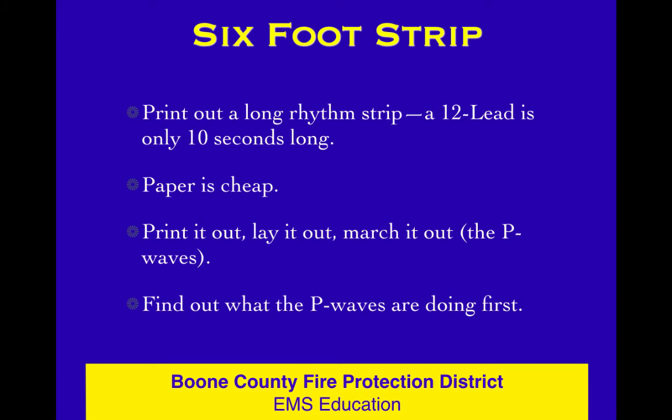Hey, you're going to be new medics. New medics are supposed to walk around with EKGs wrapped around their neck and dangling off their foot like toilet paper. You're supposed to run great big long strips. You're supposed to show everybody your first SVT that you converted with adenosine like you just birthed a baby or something. You're supposed to be freaky geeks about this. So print out great big long strips.